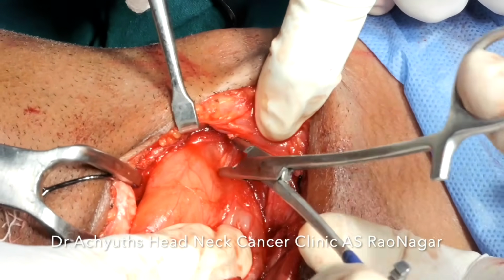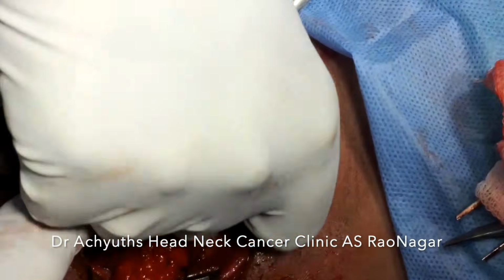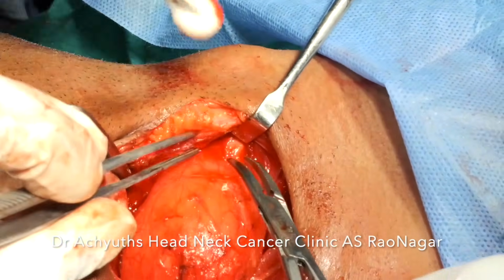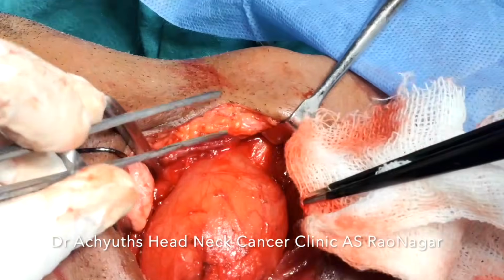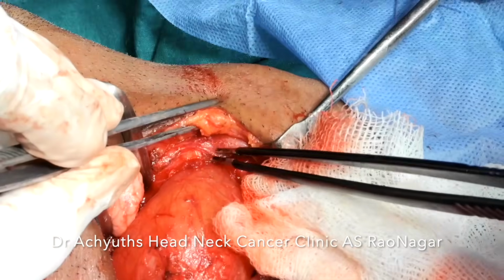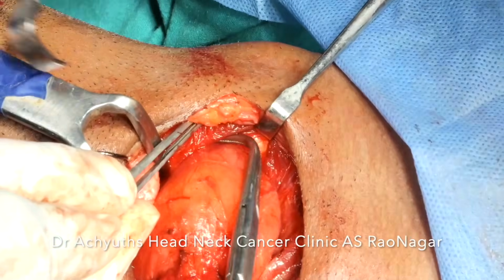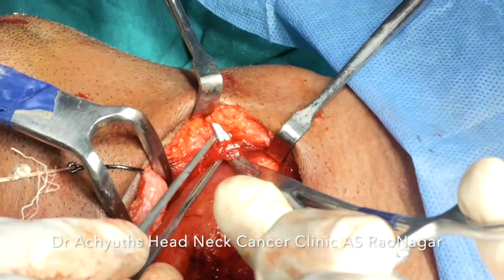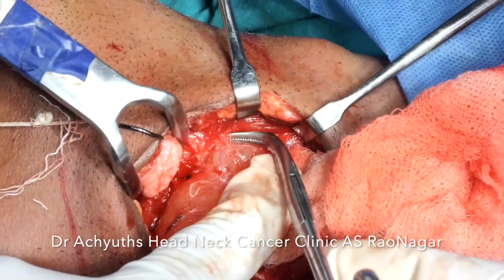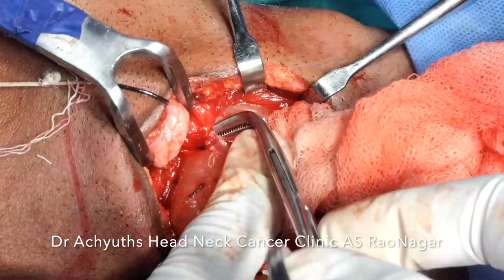Now this is the thyrohyoid muscle which is being retracted. Again, we don't want to divide these muscles for two reasons. It is important in laryngeal function, and also more importantly, it is not required to divide it during this surgery. It is only that we retract them, we go into the larynx, that's all. These thyrohyoid muscle fibers are being retracted.